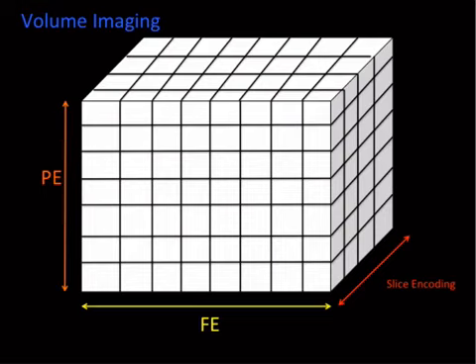So the signal-to-noise is superior, and fewer excitation steps can be used. The other main advantage is that it's acquired in a big, cubic slab. Because of that, you can manipulate the anatomy within that volume in any plane and at any angle of obliquity.